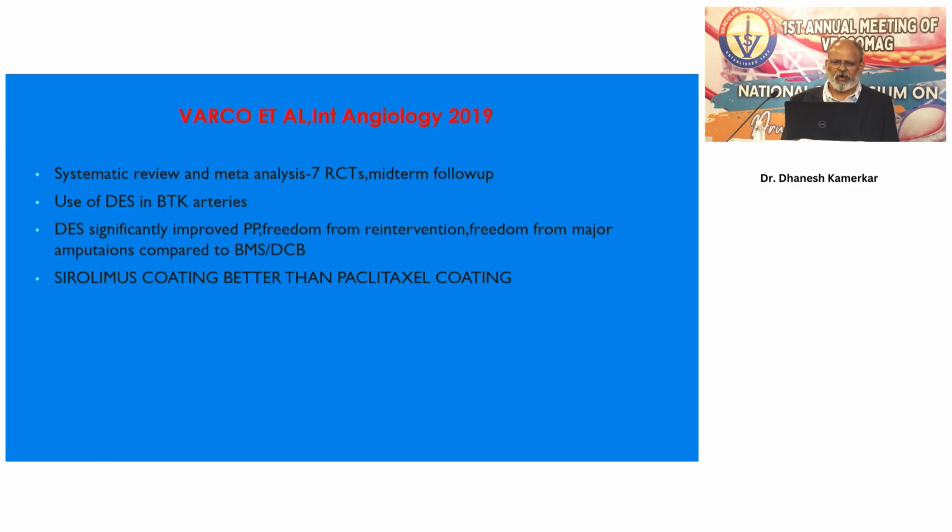This was from Raymond Varcoe, Angiology 2019, a systematic review and meta-analysis on the use of drug-eluting stents in BTK arteries. It significantly improved primary patency, freedom from reinterventions, and freedom from major amputations compared to BMS or drug-coated balloons, and sirolimus coating was better than paclitaxel coating.